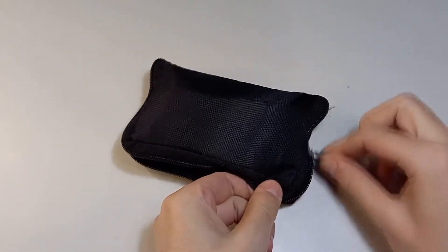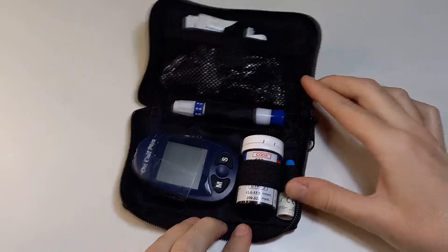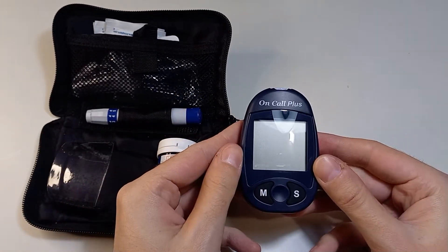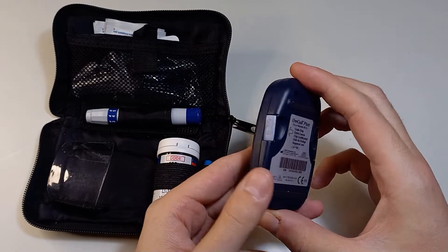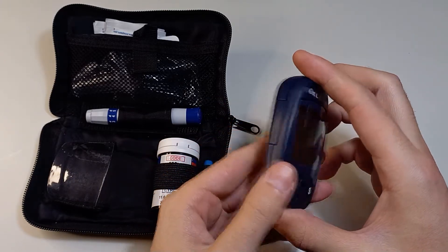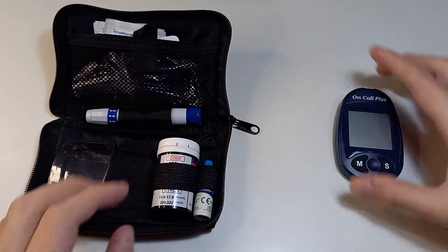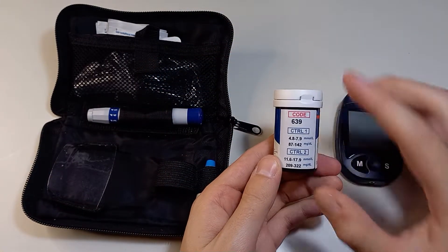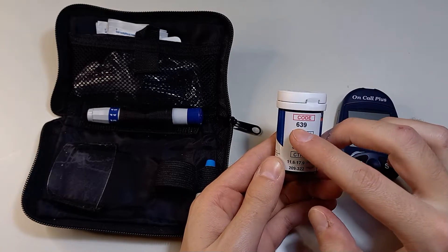Two to three times a year I check my blood glucose level with this device. I don't have any problems but this is just to be 100% sure. The test strips are inside this container — you can see a 3-digit code on the label.